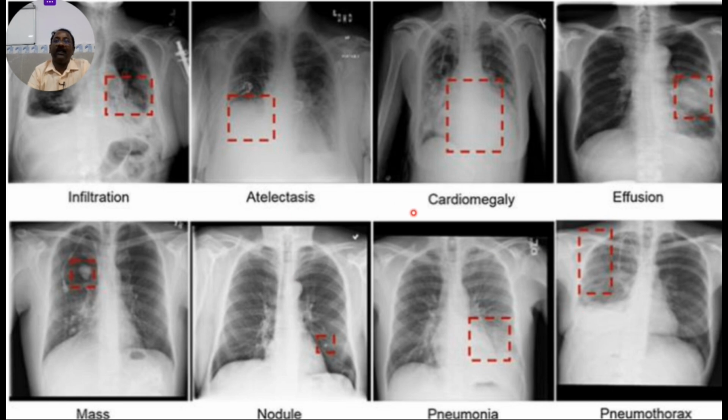So whenever you see an X-ray, you have to think of all these things. So don't be in a hurry in reading a chest X-ray. Take your own time, but don't miss any abnormality in that particular X-ray.